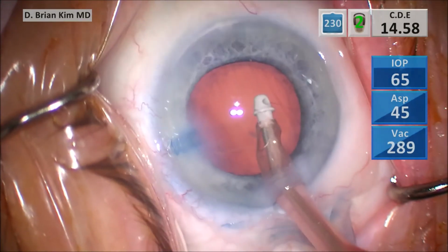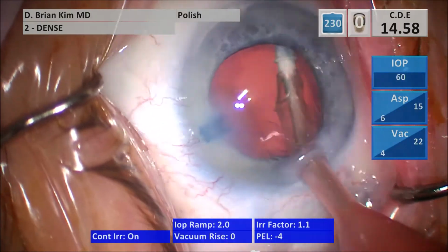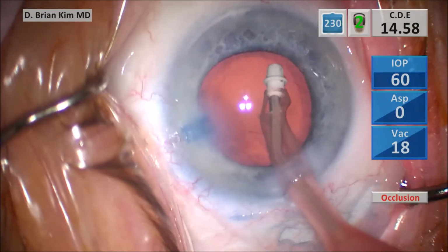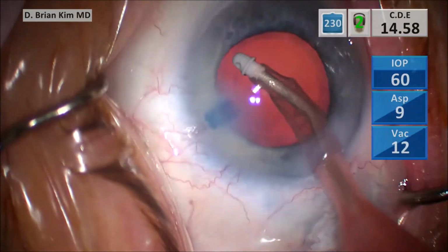Again, with the dense lenses, I'm always concerned about zonulopathy. So I switched to polish mode, polishing underneath the rhexis edge. You can see some fine stringy things. I'm polishing the posterior capsule as well.